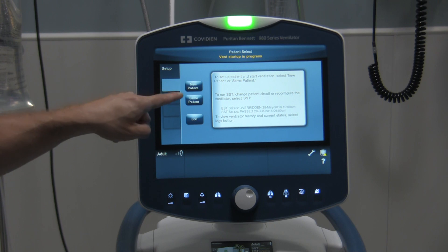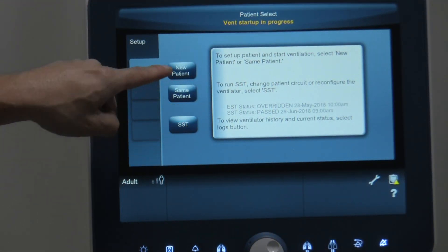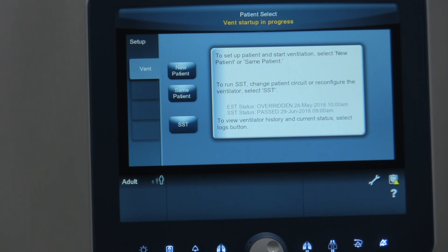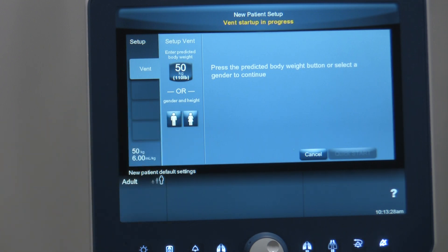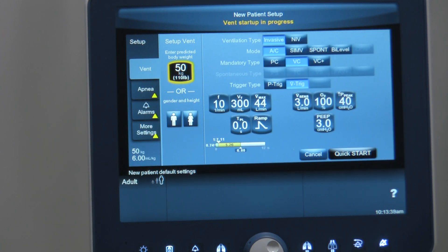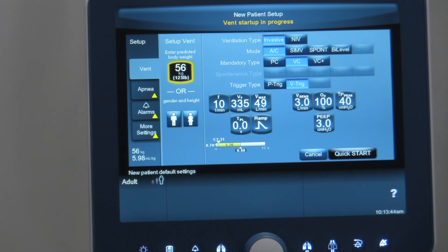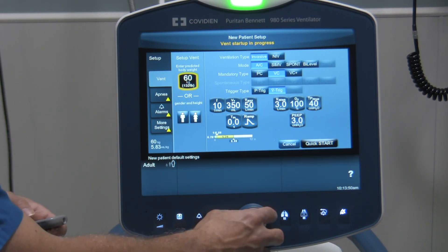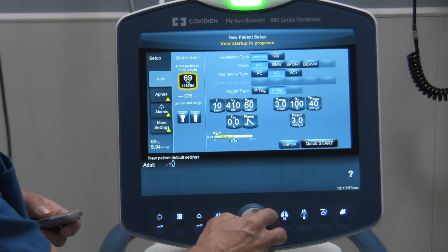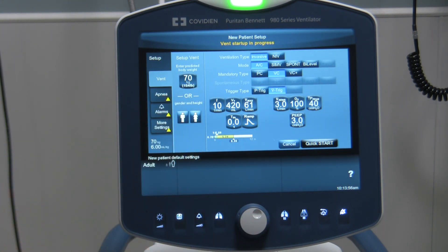Let's zoom in so you can see the tabs better: new patient, same patient, SST. So we're going to go into new patient. As soon as it comes up, you can either choose from the gender of your patient, or you can simply enter their ideal body weight and program that in. So if we had a patient that was 70 kilos ideal body weight — you can get that usually from the chart — activate that, and now you can just change the value with the knob down here. So we'll set 70 kilos and accept that value.